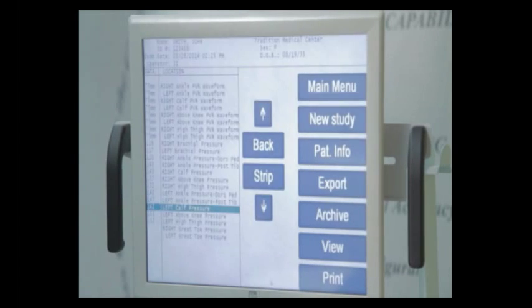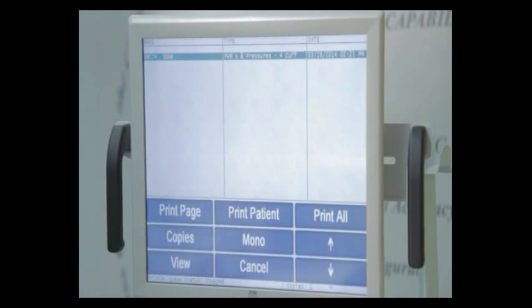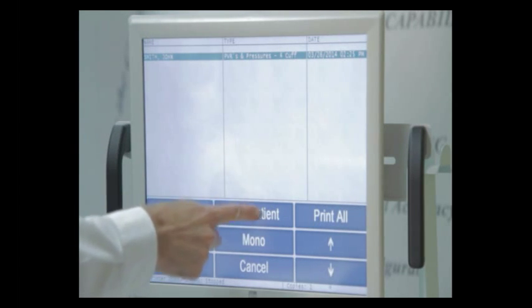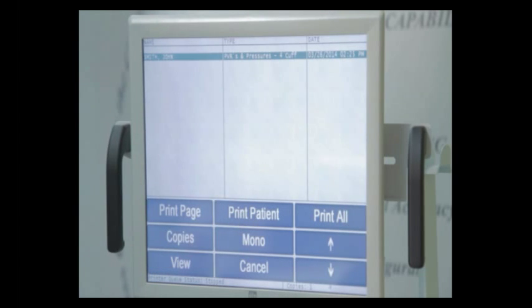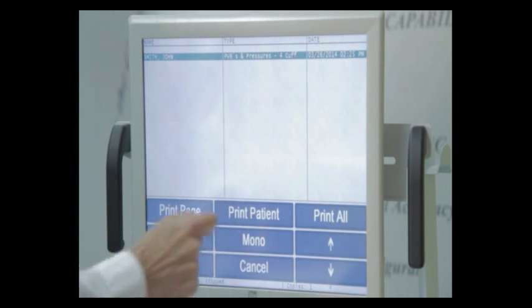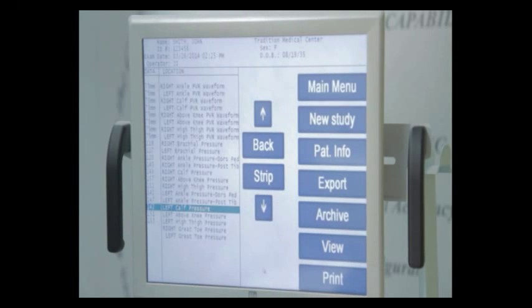If I want to cancel that, I can also print if I like. The print function is very much the same way. I can print just a single page. If I have a multi-page report, by pressing Print Patient, it will print those multiple pages with one touch. If I want to print in black and white, I can press the Mono button to save on ink. I'm going to cancel, and the same thing with Archive.